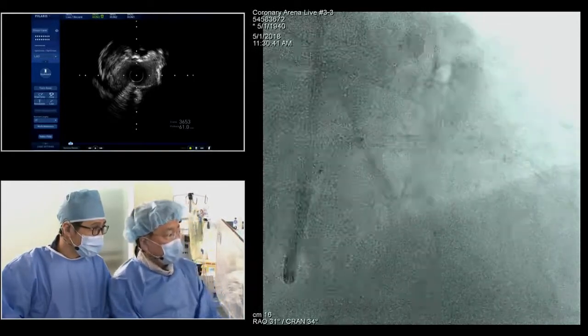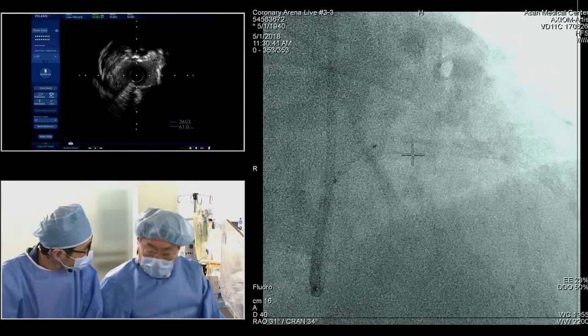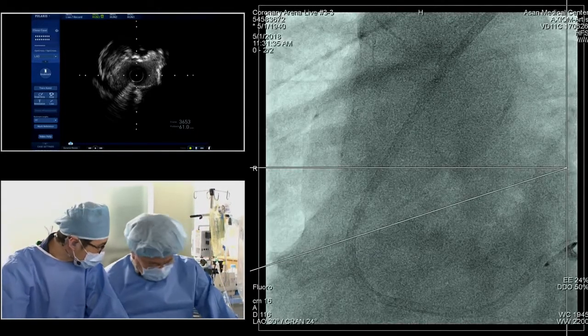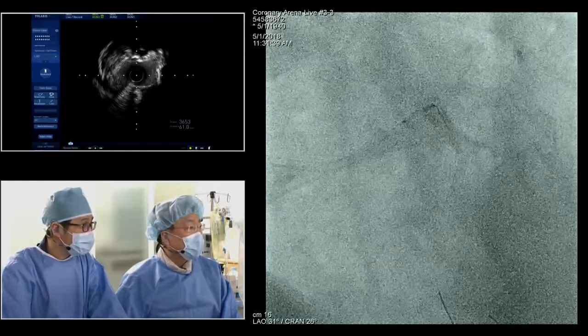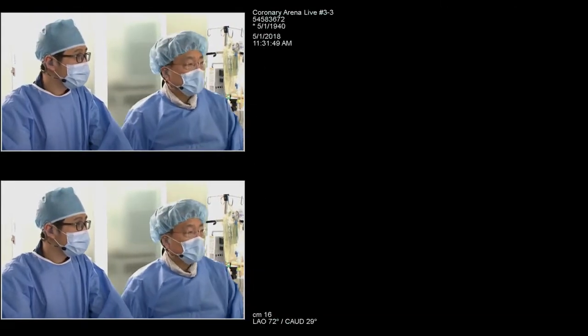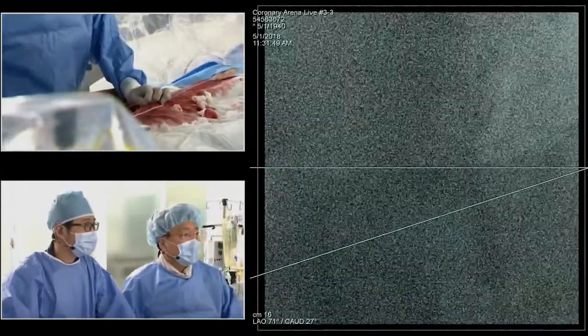I think it's okay so far. Spider, aerial. No, okay, I will take it. That one. Yeah, maybe Dr. Wu wants to see this view, test, ostial part, and would you check that one? Screen, okay. Spider view, also, you can recognize, take a look.